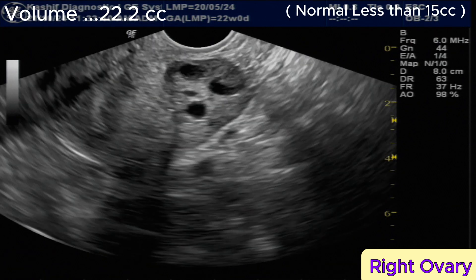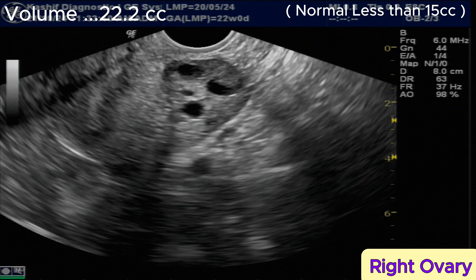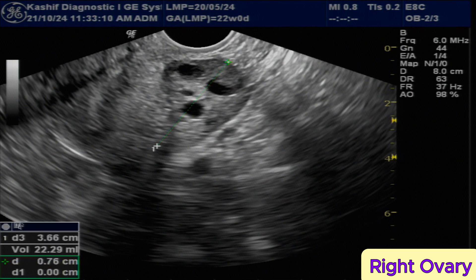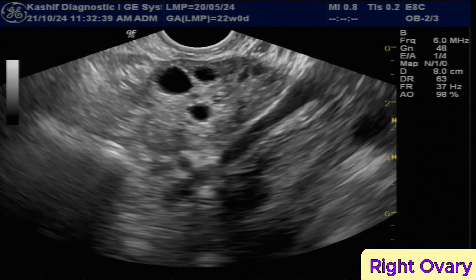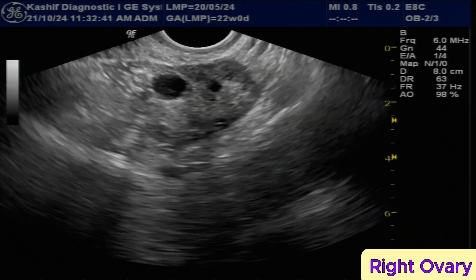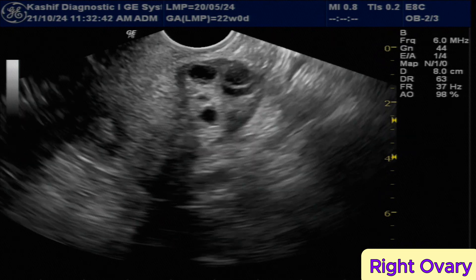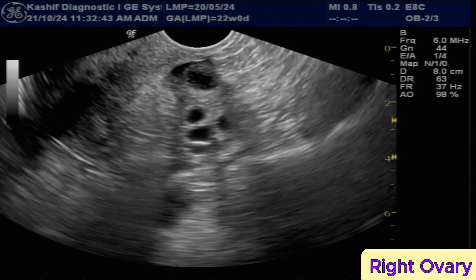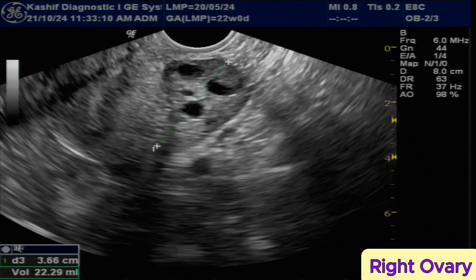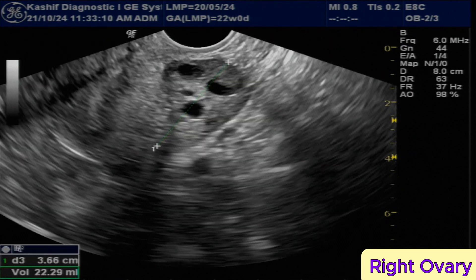This is an enlarged ovary with increased parenchymal echogenicity. There are multiple small follicles in the ovary measuring 3 to 6 mm, approximately 16 in number.